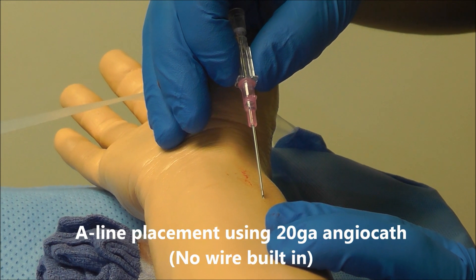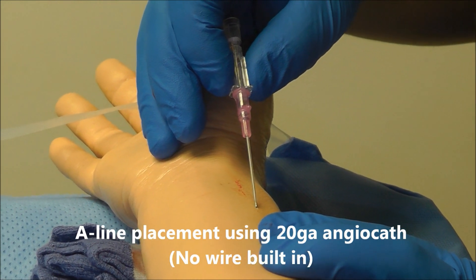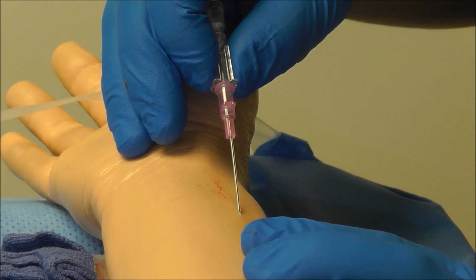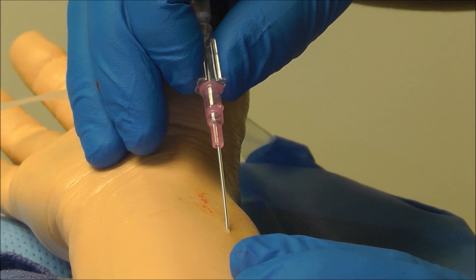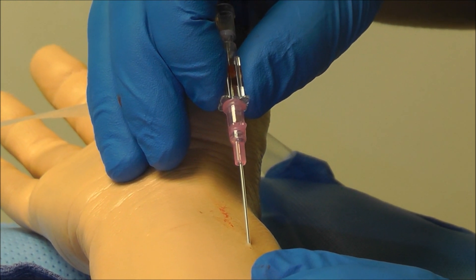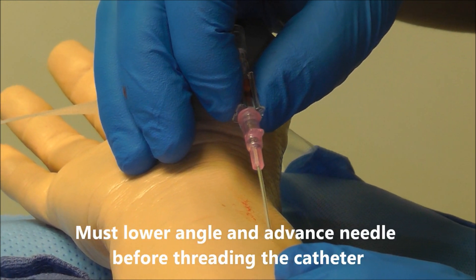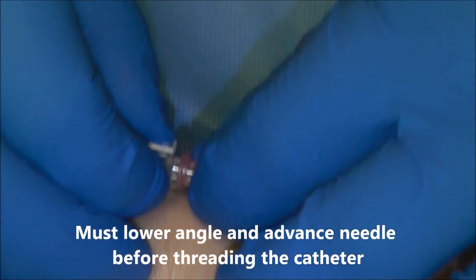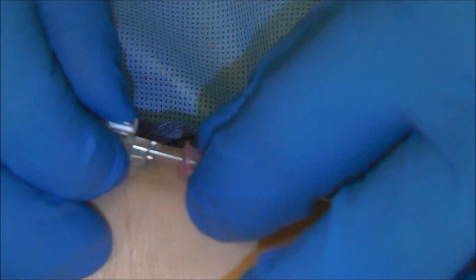Palpating the pulse, insert the needle at a 45-degree angle to the skin, advancing slowly until you see flash back into the hub. Now that I see pulsatile blood flow into the hub, drop the angle. Now that I've dropped the angle of my catheter, I advance slowly and advance the catheter using a twisting motion over the needle.